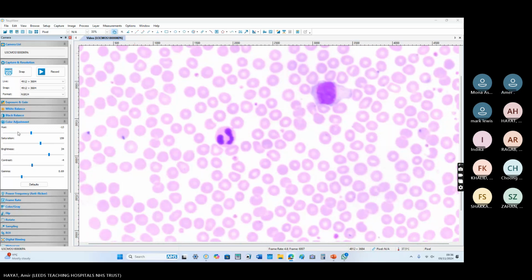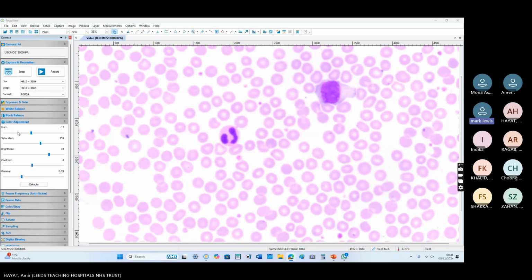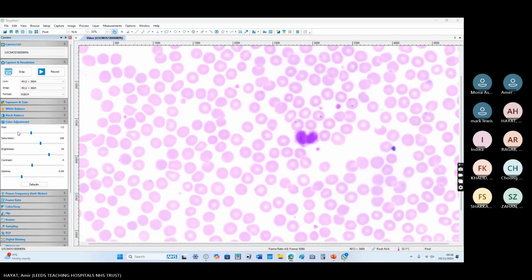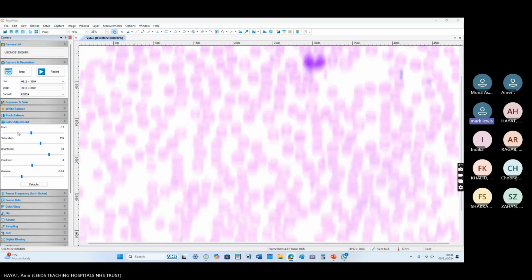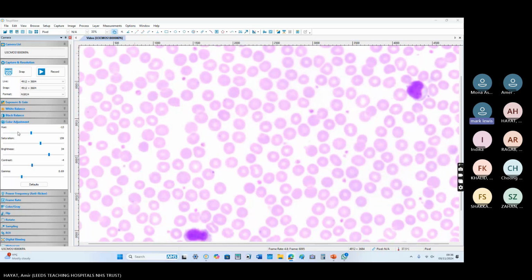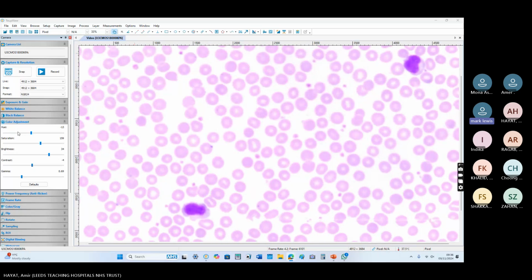So how would the lab hematologist or biomedical scientist report this? Well, I'd say marked thrombocytopenia. I need to see a bit more. Okay. The whites. He's come in with swollen neck glands, is he?